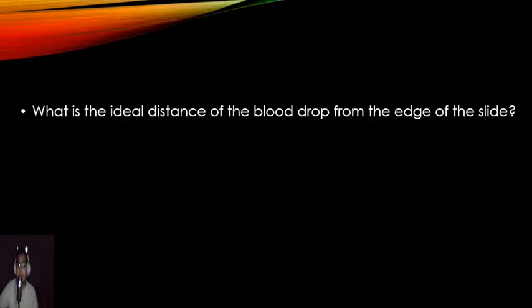Yeah. I remember when a student asked me before when I was still working in the Philippines, sir, bakit sila ma'am gumagawa by finger stick needle, but ikaw ayaw mo sa finger stick. One thing that I noticed is it's dirty. For practical reasons, it's dirty. And for microscopy purposes, the distribution of the cells is, as you've said, not equal. It's not really good.